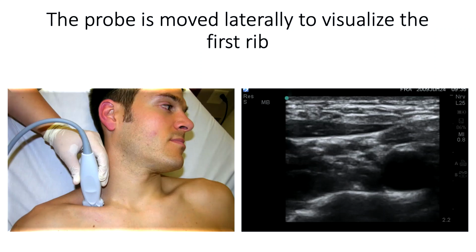But it really doesn't matter, as I was trying to explain to you, that now you recognize that that space contains everything you want to block. Now it's just a matter of bringing the needle into that space and injecting local anesthetic into that space. So that's how I conceptualize this in my head, and that's why I don't chase nerves.